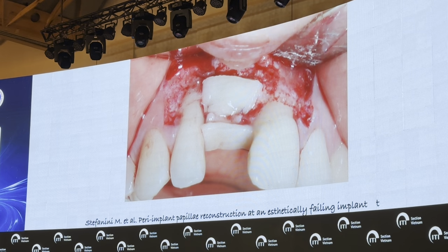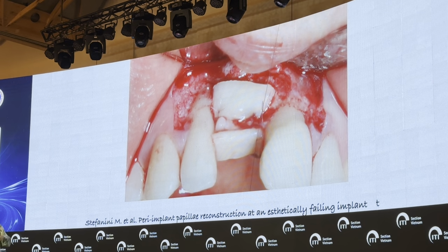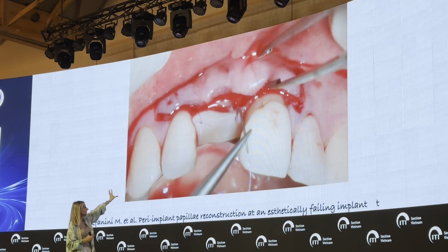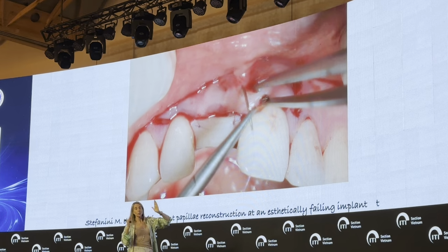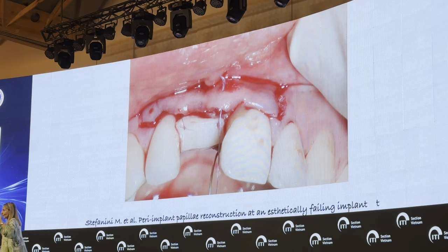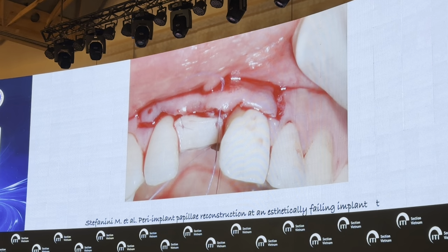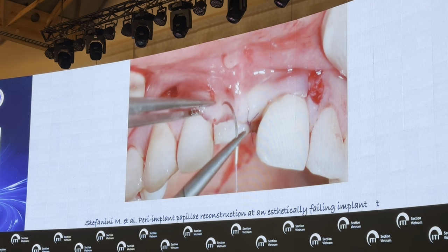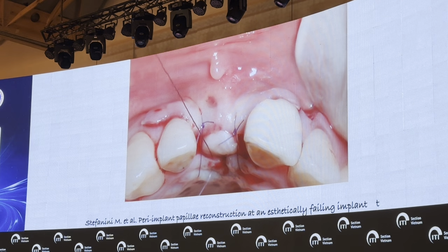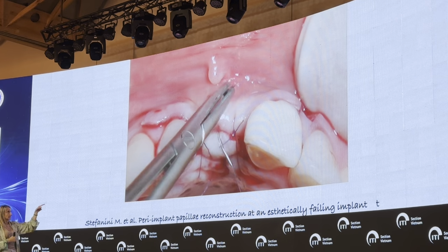And since I need to reach this level in terms of coronal improvement of the tissue, you see that the position of the second layer of connective tissue graft applied into the platform is because I wanted to cover the gingival recession on the neighboring teeth. So I need to coronally advance the flap and cover the cemento-enamel junction at the interproximal level on the two adjacent teeth neighboring the edentulous area. This will allow to recreate the peri-implant papilla for the implant that is in position.